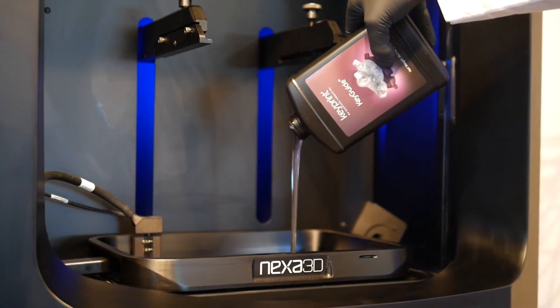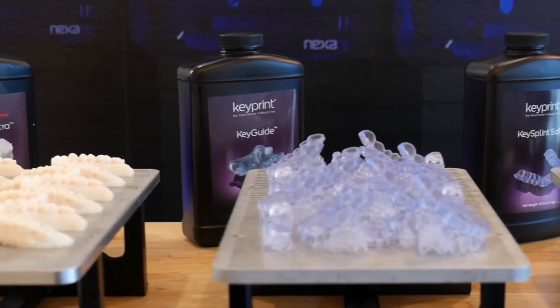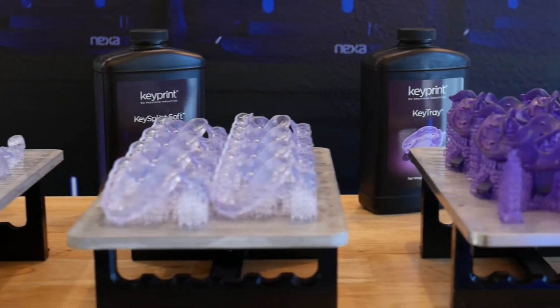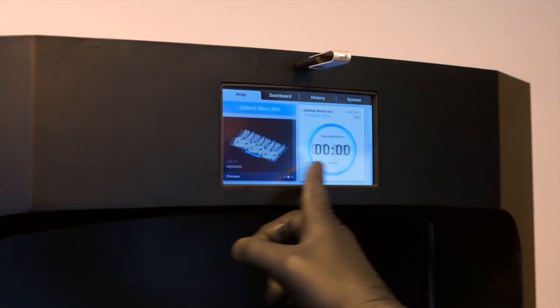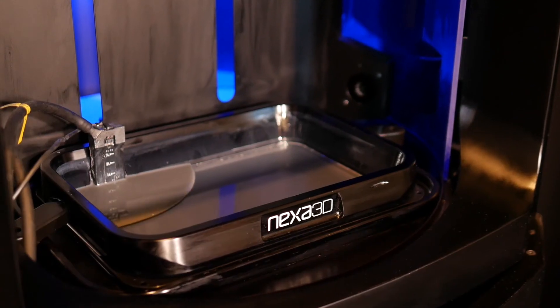Nexa 3D has partnered with Keystone Industries to provide users of the NXT 200 with fully validated workflows on key print materials, including Key Model Ultra for dental and thermoforming applications, Key Guide for surgical guides, Key Splint Soft for splints, night guards, and bleaching trays, and Key Tray for customized impression trays — with more materials on the way.